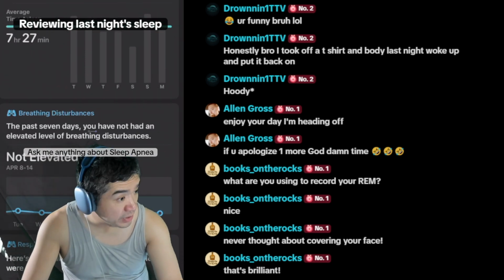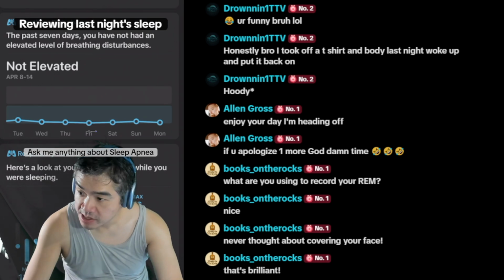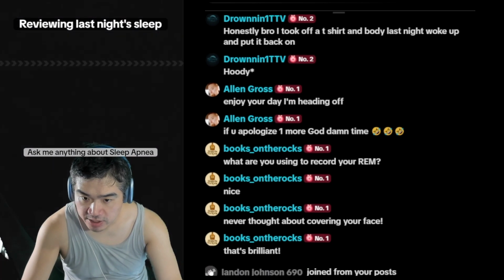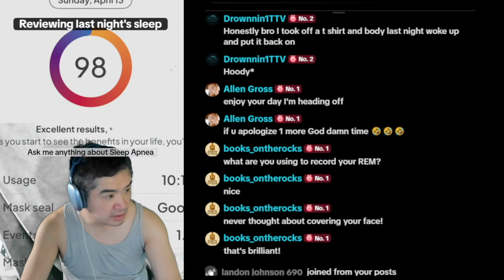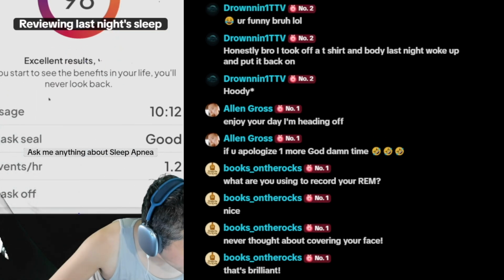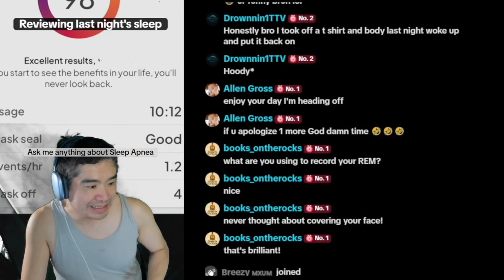Okay, again, breathing disturbances, not elevated. Not a surprise for someone who's treating their sleep apnea. And what else do I have to look at? I think I have my air score, 98. Usage is 10 hours and 12 minutes, but I only slept 7.5 hours.